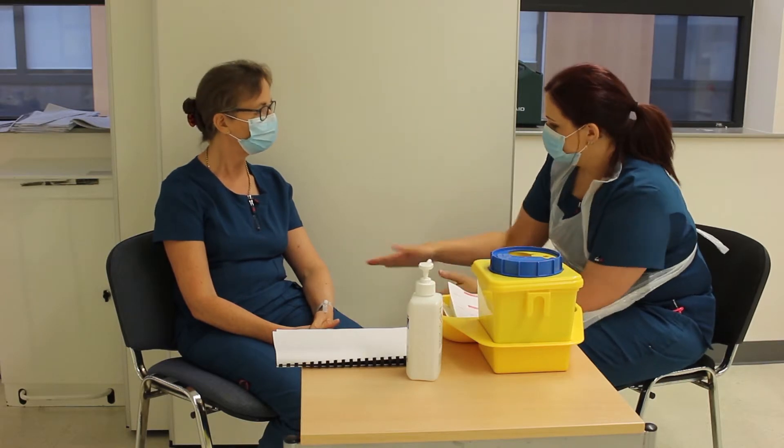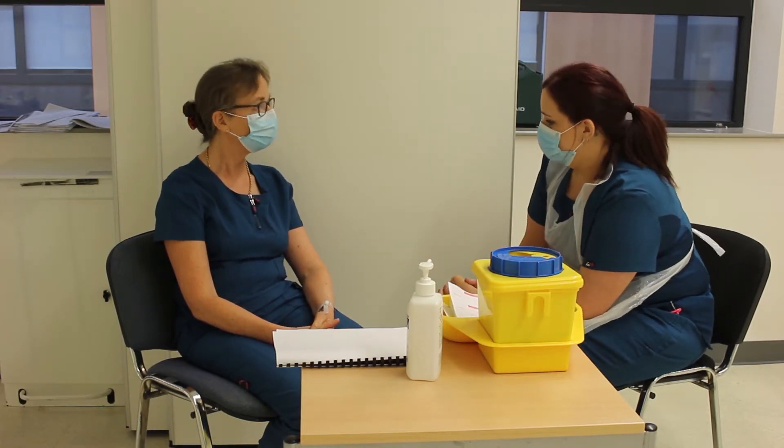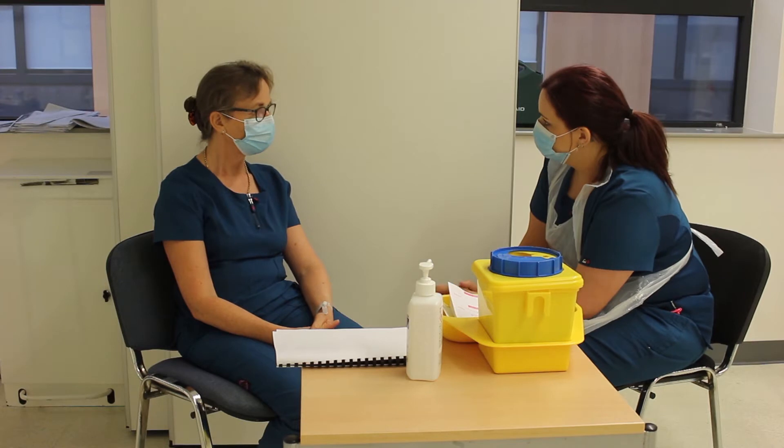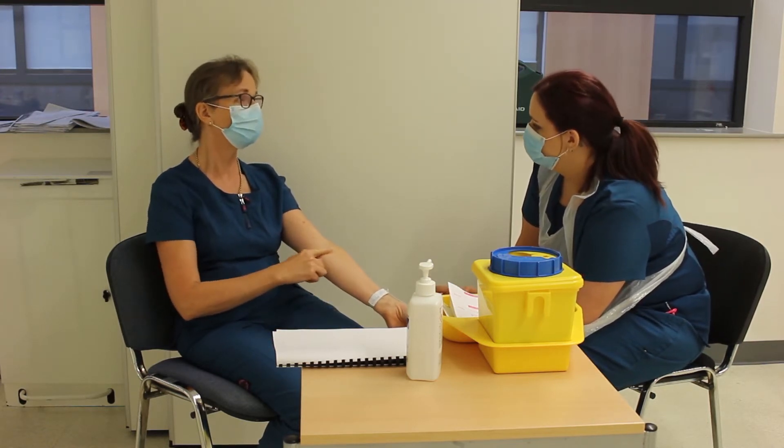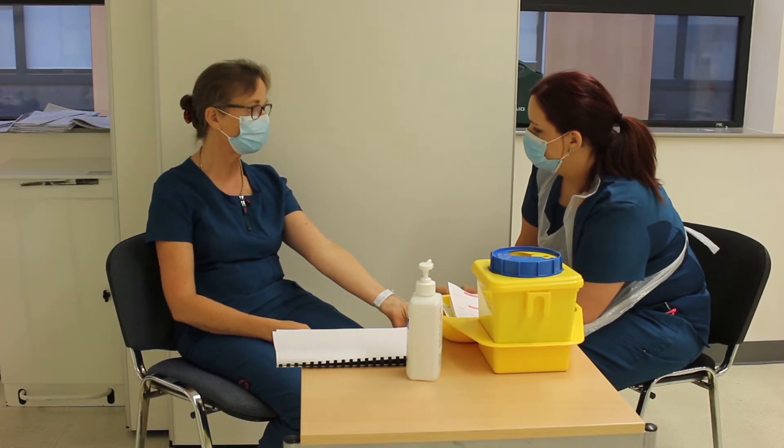You've used this arm previously. Yes. Is there a section they've often used? Yes, I'd specifically like if you could try here. No problem — if that works best, very good.